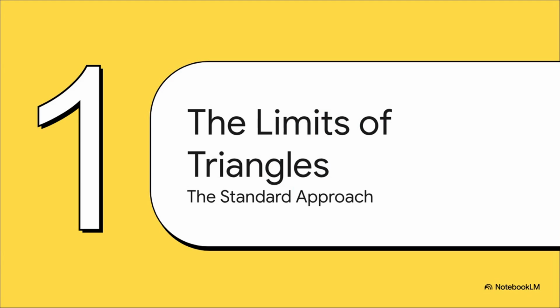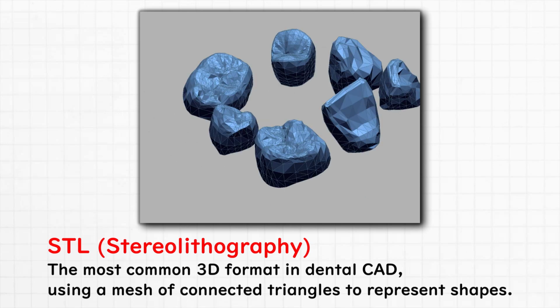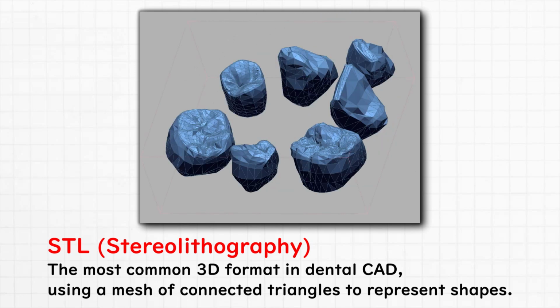Okay, so to really get where we're going, we first have to understand where we've been. Let's kick things off by looking at the standard approach that's used in most dental CAD software today, and why it's starting to show its age. Right, so the foundation of most digital dentistry is a file format called STL. You can think of it as a universal language for 3D models.